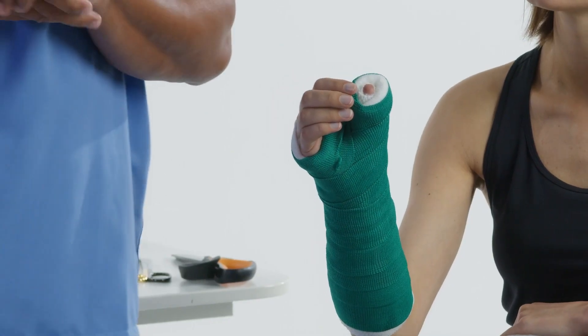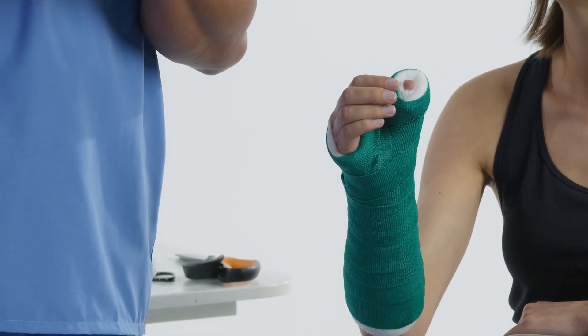Welcome to Deltacast Tutorials. Today I'm going to be applying a thumb spica non-removable.